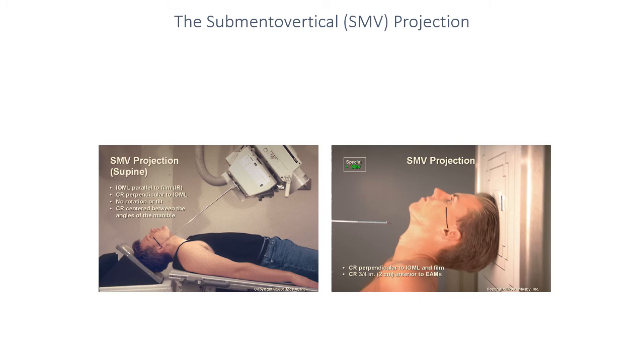I don't actually advocate using this position, basically because it's a lot of mucking around with that image receptor there, when we probably could get the patient through a greater degree of hyperextension by putting some pillows underneath their back. So that photograph on the left, not so useful.